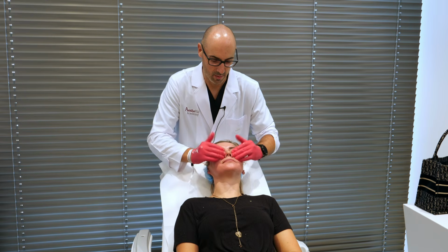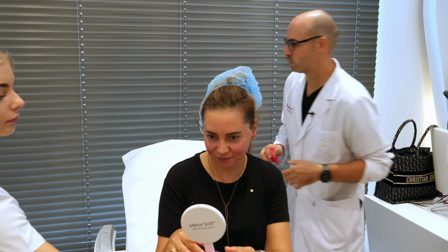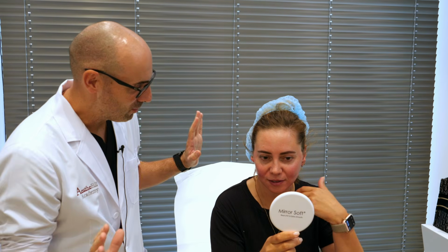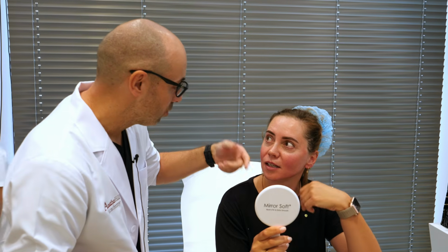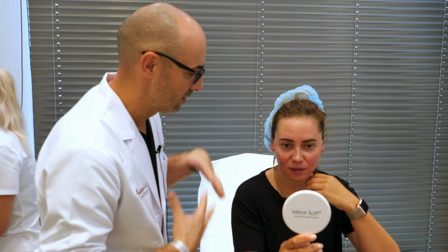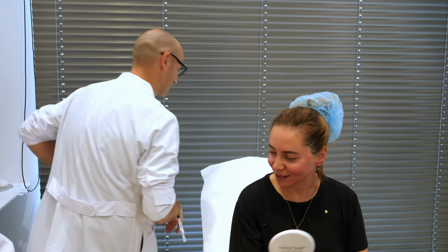Well, this is the finished result, sit down please, okay? Perfect. Give me the mirror, please. Perfect. How do you see? Oh, amazing. In a few days, better. You can touch and feel the difference in the lower third. Well, definitely, it feels more tightened. Oh, tightened, okay. Perfect. Thank you so much.